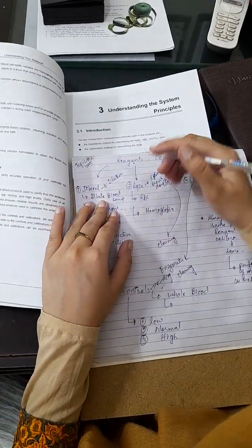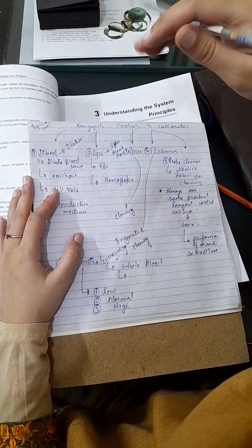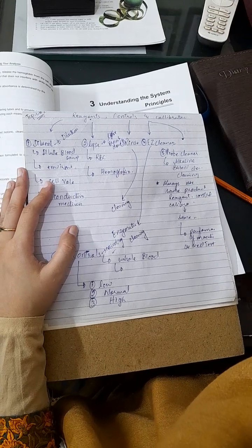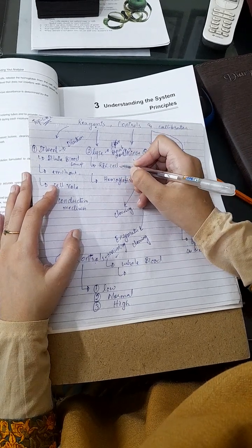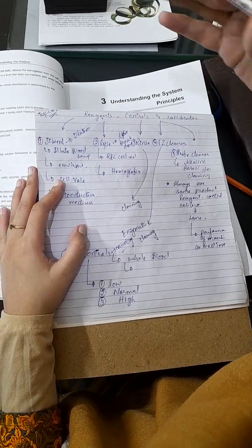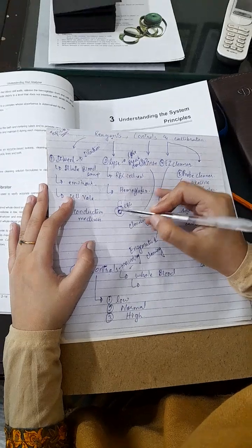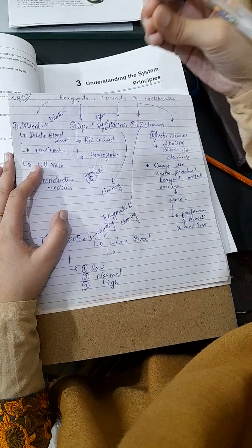The first reagent is diluent. The second reagent we use in the BC-2800 is the lyse. As the name indicates, the lyse is a breakdown reagent which breaks something down to make processing easy. It breaks down the RBC's cell wall and releases the hemoglobin from the cells. As you know, in an RBC there is hemoglobin. So it removes the cell wall of the RBC and releases the hemoglobin. As you know, we also have to measure the hemoglobin.